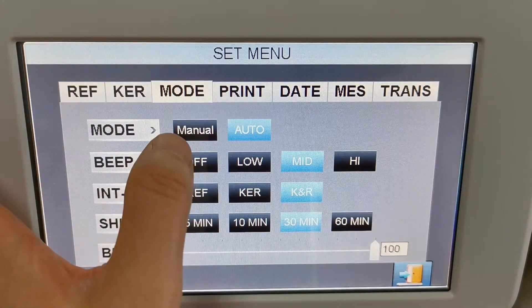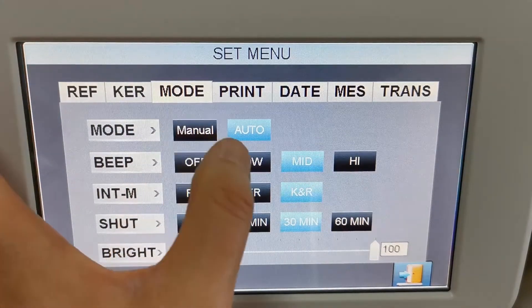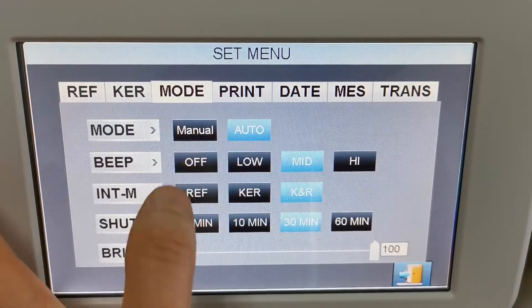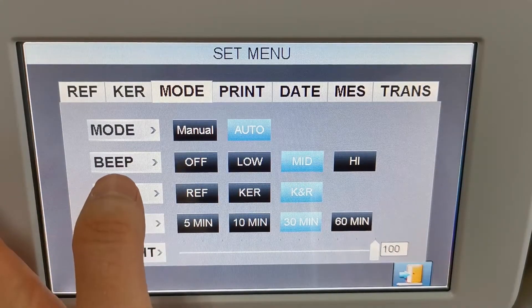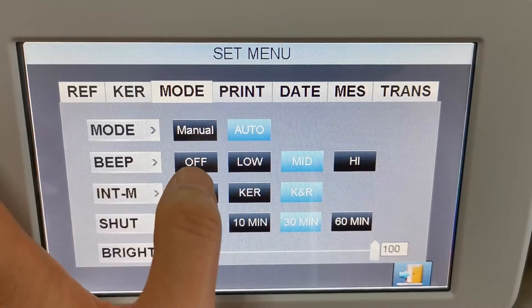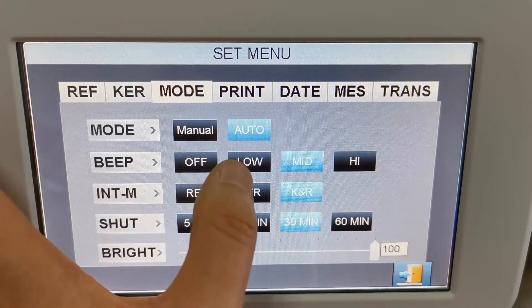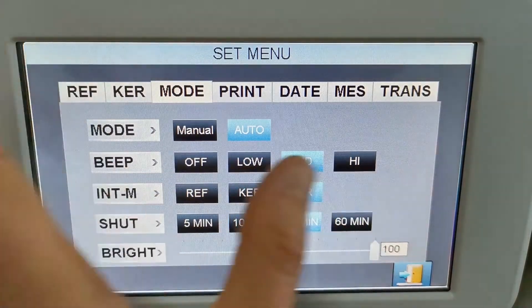This is the manual mode and this is the auto measurement mode. And you can change the volume for the beep — you can turn it off or make it low, middle, or high.